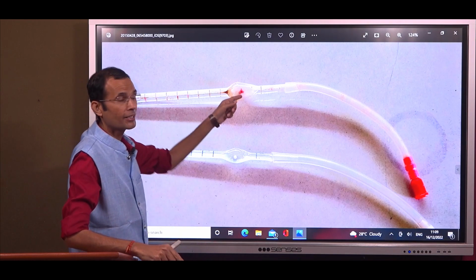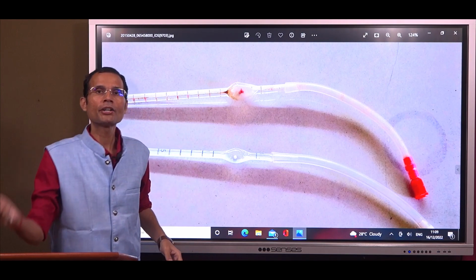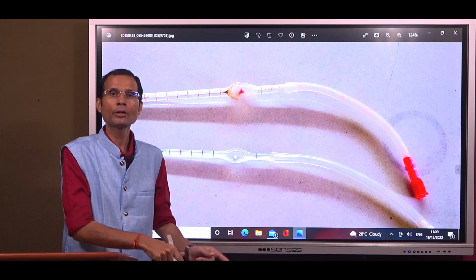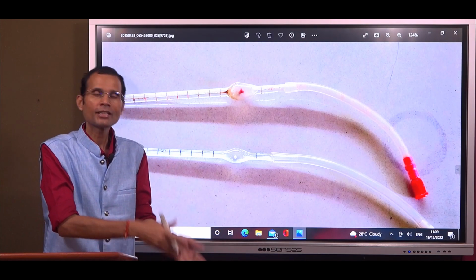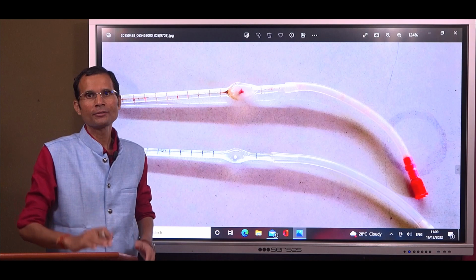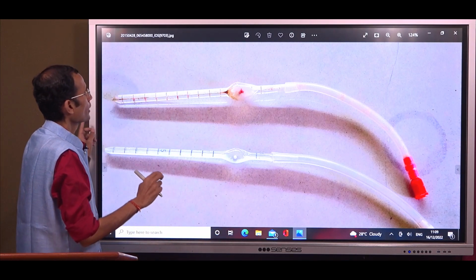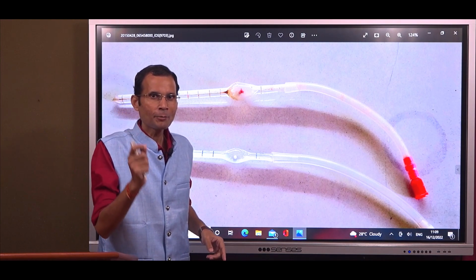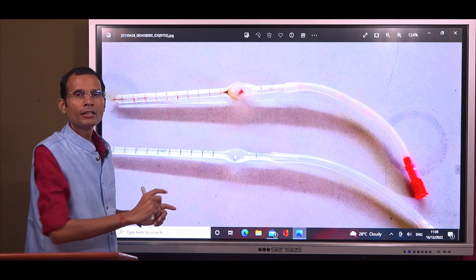Capacity of the bulb is 100. So 0.5 parts of the blood diluted to 100. That means 1 part diluted to, come on, complete the sentence. 1 diluted to 200.